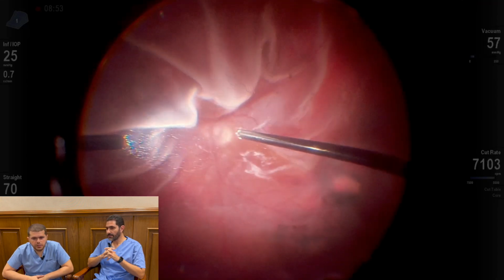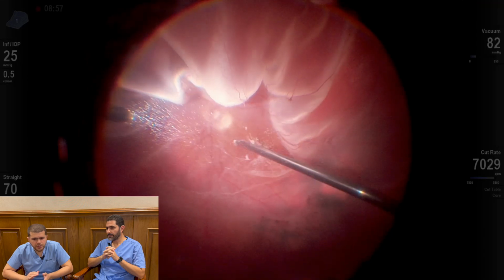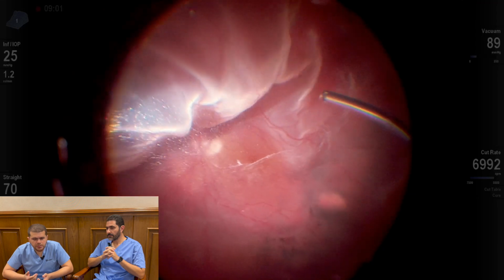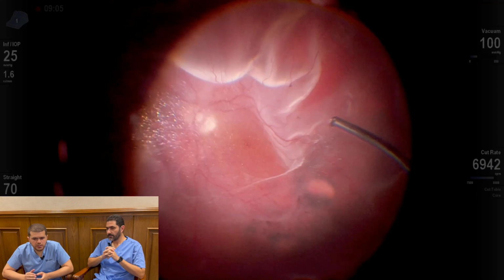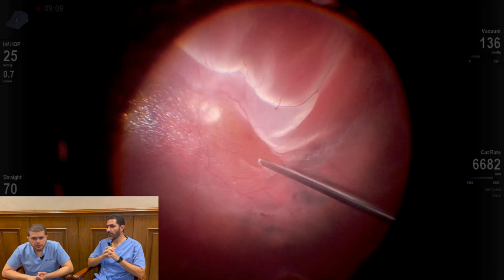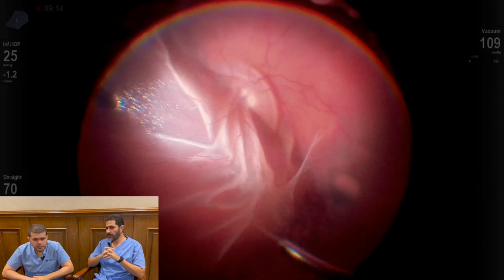In these cases, you generally use triamcinolone more in pediatric as well? Yes. Okay, and now I succeeded to detach the posterior hyaloid from the disc and macula and posterior pole, and now continuing to try to detach the hyaloid from the rest of the retina. Wouldn't you be eager to add some PFCL? I will in a moment, yes.